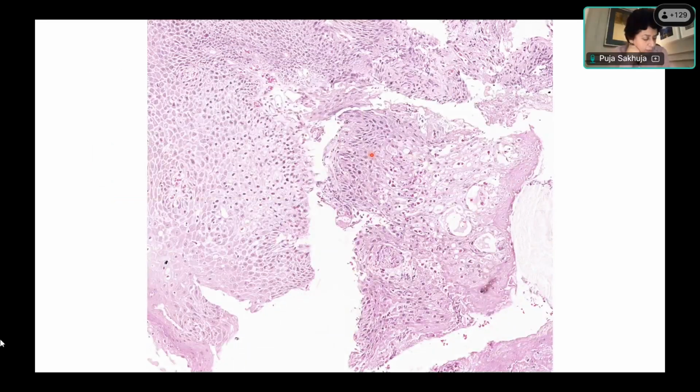Who is left? Who has not described a slide? Everyone has described one slide? Yes, ma'am. Okay, then we go back. Anyone wants to describe this slide?